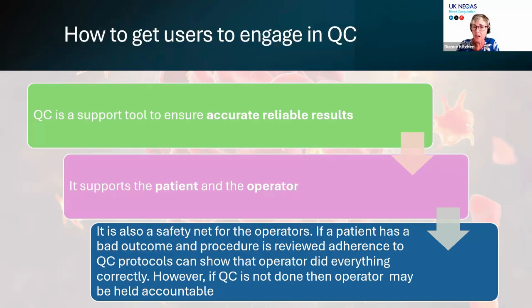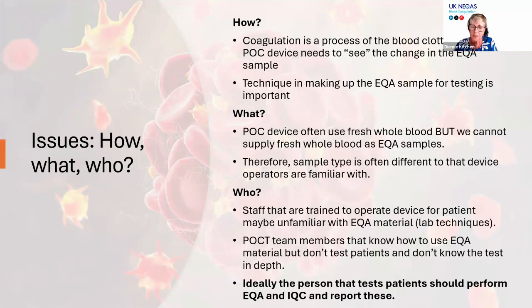You need to check that your device has got its procedures in place before you do any testing. I think that's really important to press upon them and get them on board with doing both your IQC and your EQA. So I've titled this the how, what and who.